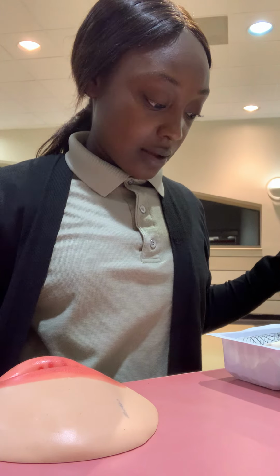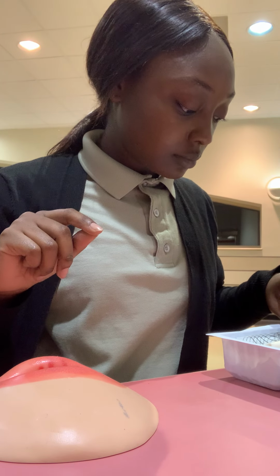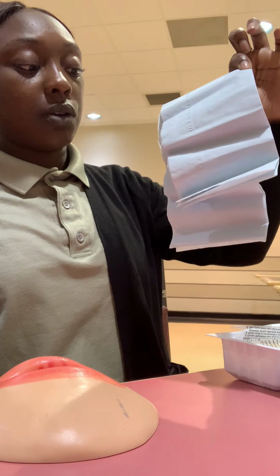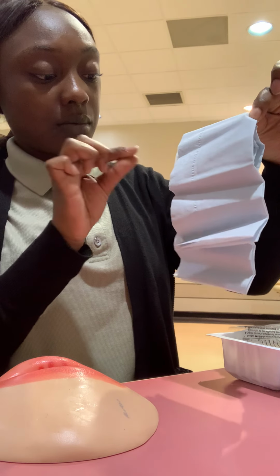So now I am going to grab this first to create my sterile field, and I'm going to place it shiny side down.